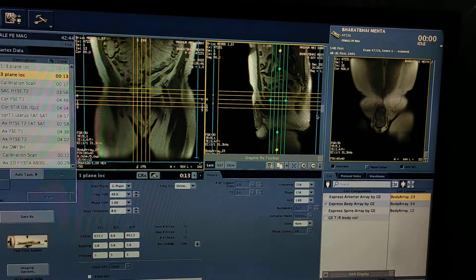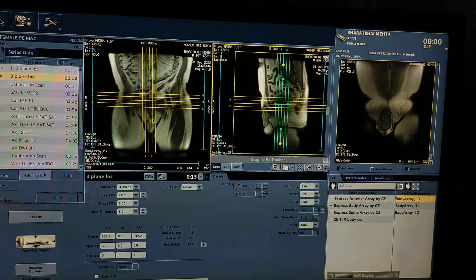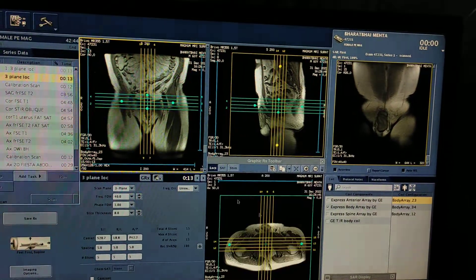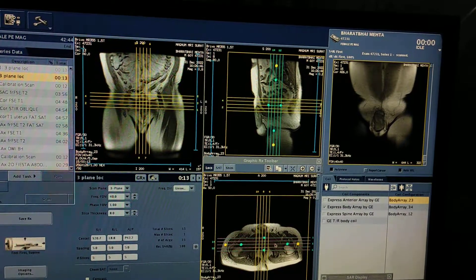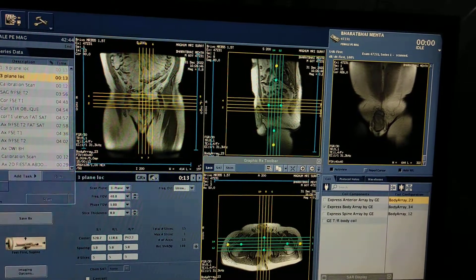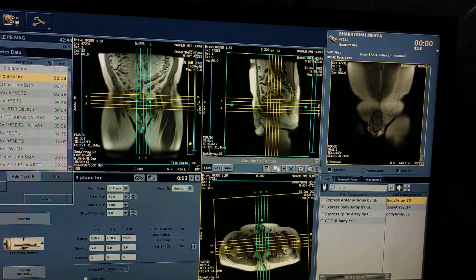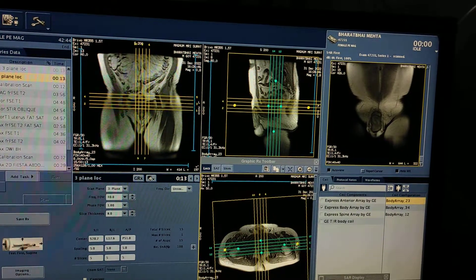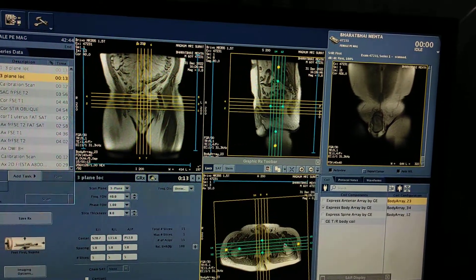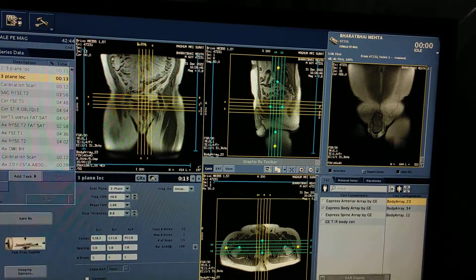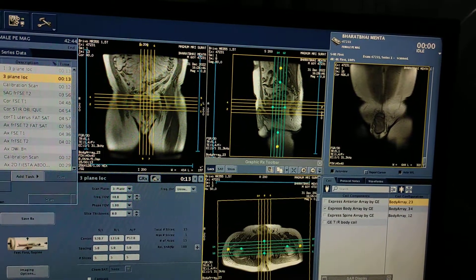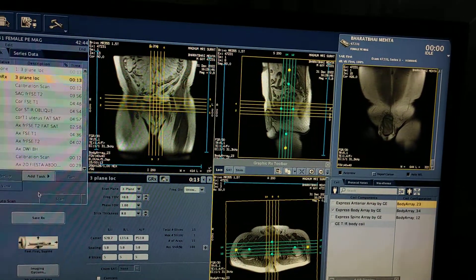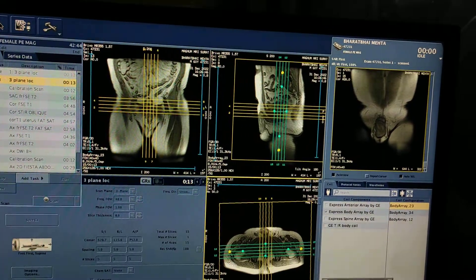The doctor has suggested to do MRI prostate. Here is the first localizer; now I am just relocalizing it for a better and proper position to scan further. Again relocalizing — save scan.